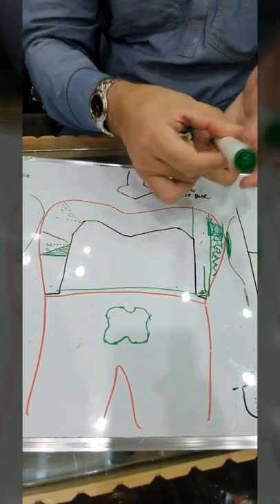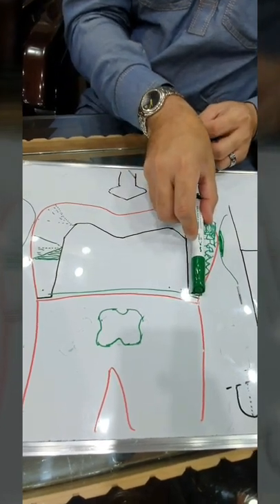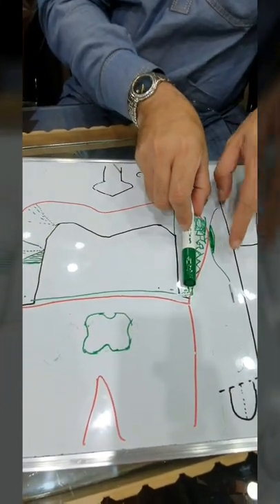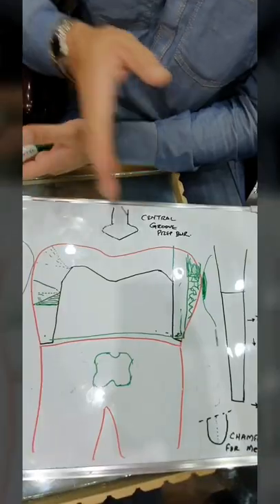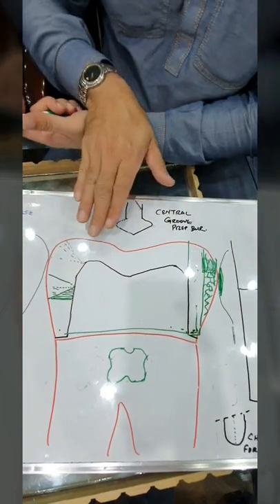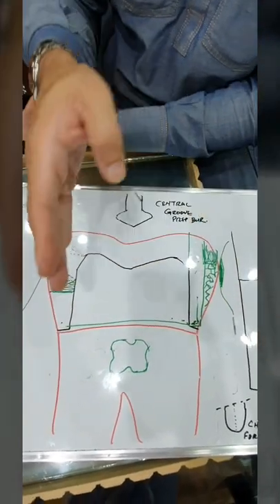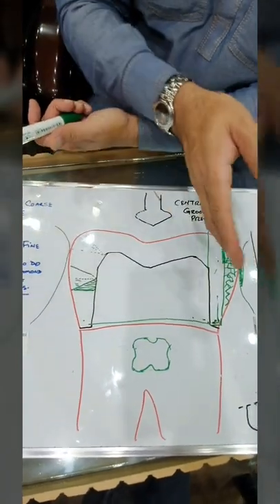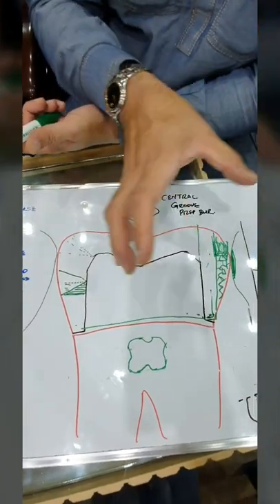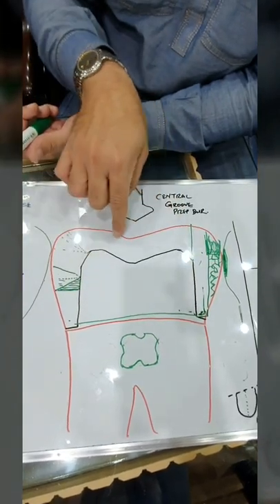So here'll be a representation of it. If this is the burr, you do it like that, and you go from facial all the way to the lingual, and the adjacent tooth will be safe. Preparations, like I said, I would do the facial separately, I would do the lingual separately, then I would connect the facial on the distal to the lingual and on the mesial to the lingual. By this time you have a nice prep all around with convergence in the walls, nice smooth margins, and the only thing that remains is the occlusion.